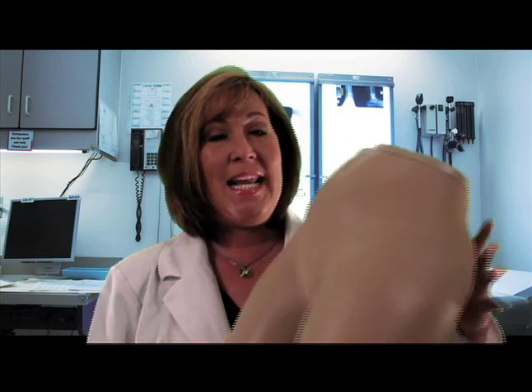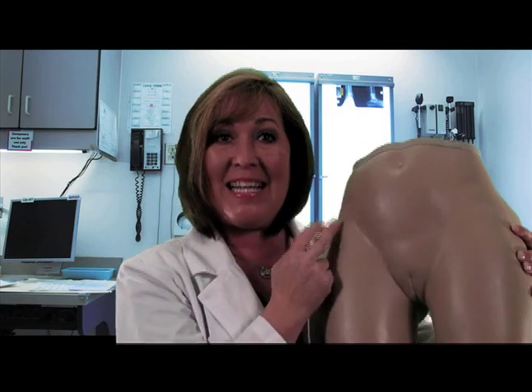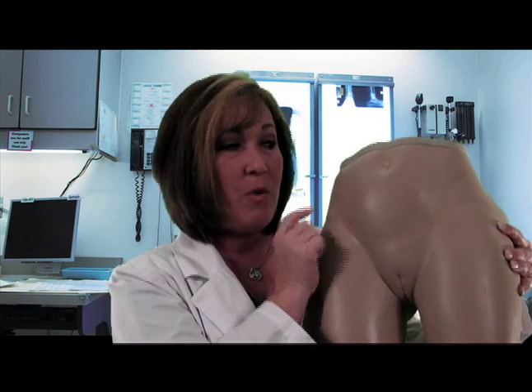As you know, there are many landmarks for the subcutaneous injection. Let me show you the mannequin. Today, we're going to talk about giving it around the umbilical area. Other landmarks are on the legs. We're talking about our subcutaneous fat — anywhere on our body that has that added fat is a good landmark for the injection. But on this mannequin today, we're going to talk about the abdomen. You want to make sure that you stay around the umbilicus, but about two inches away from the actual umbilicus itself.